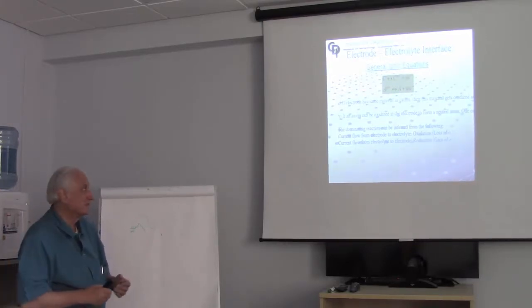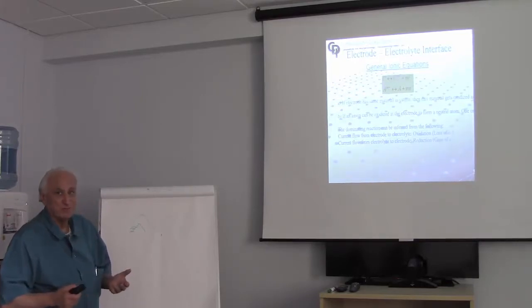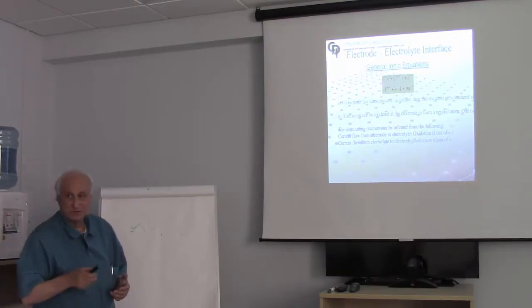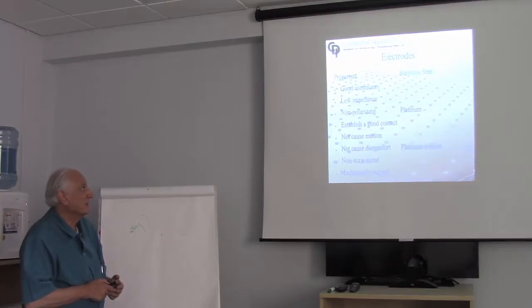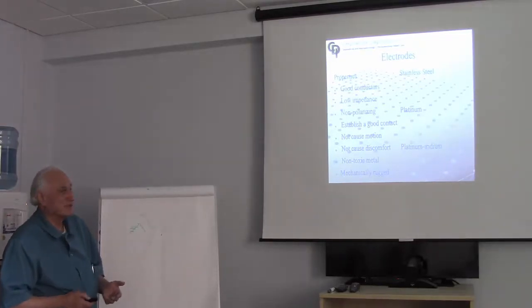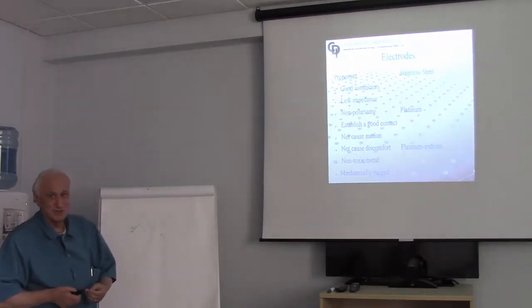Goes back to the thing we talked about with charge, movement of charge. So if you remember that conversation, you pretty much have the ideas. And this stuff's all in the notes, so we can skip over this pretty quickly. You know, you want good conductors, low impedance, non-polarizing. You want to establish a good contact. You don't want to have motion artifact from the electrodes. You don't want the electrodes to cause discomfort.